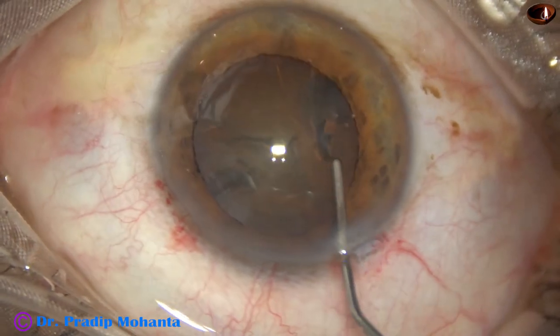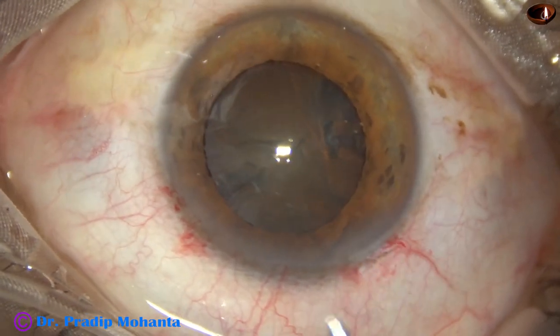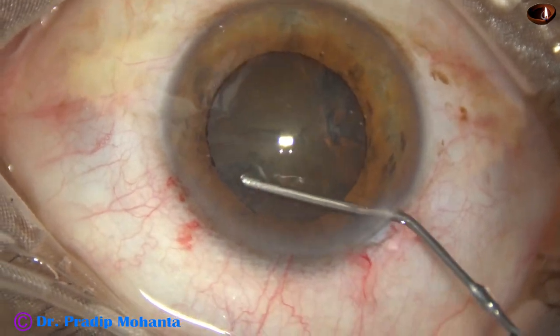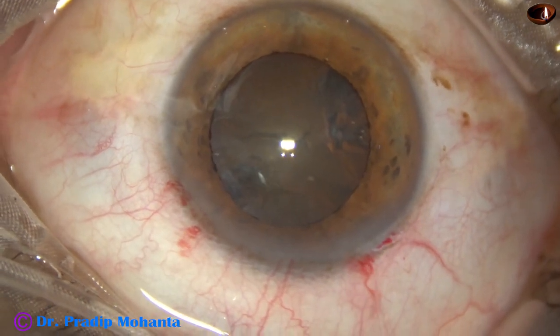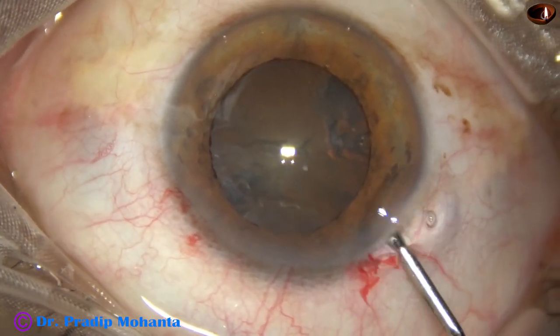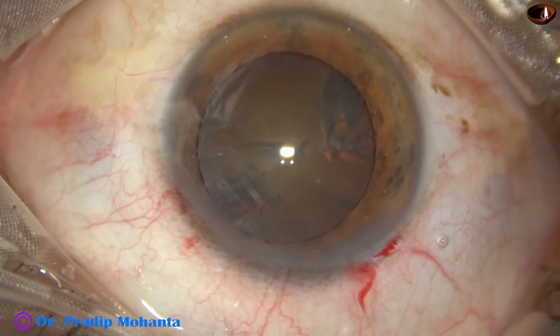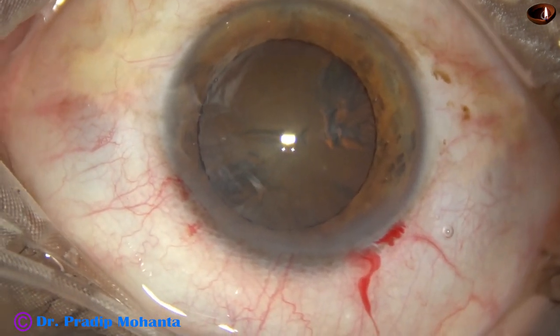Fourth attempt. As I touch the iris, the pupil starts coming down and becoming small. As I inject viscoelastic, the pupil dilates again.